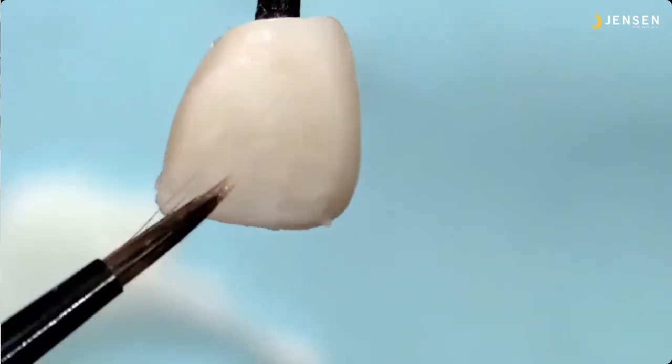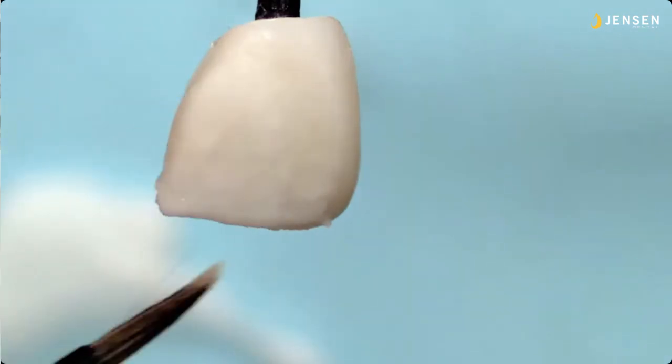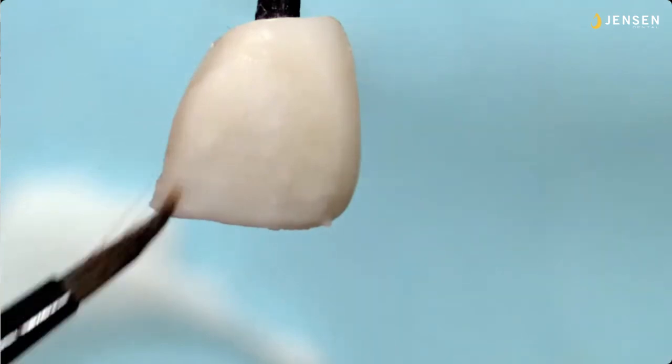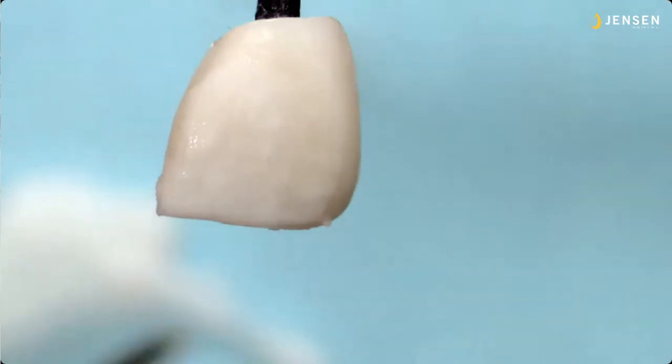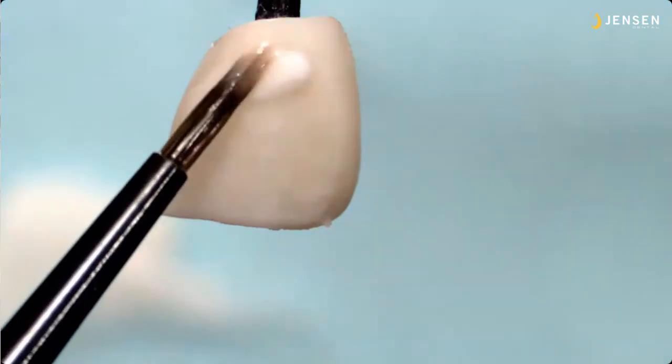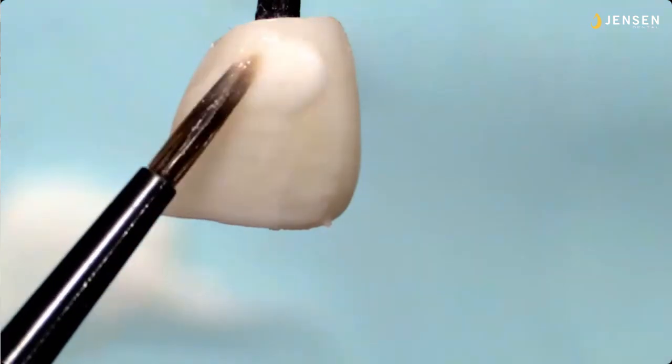And by the way, when you poke those little holes to see how deep it is, don't forget to close the door. In other words, don't forget to seal those little air holes where you poked with your endo file, because it will bake with little holes in it, and you'll be frustrated when you realize that you forgot to fix it, because you got to come back and do something. It'll show.